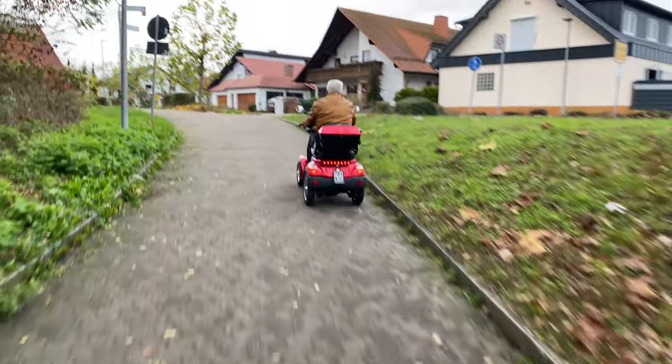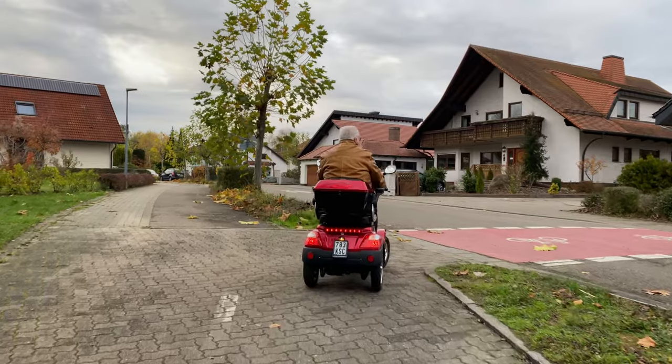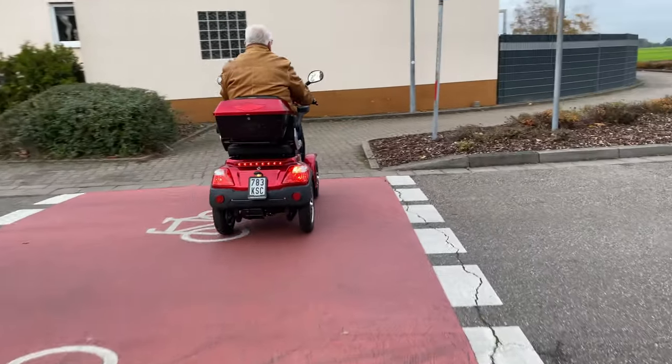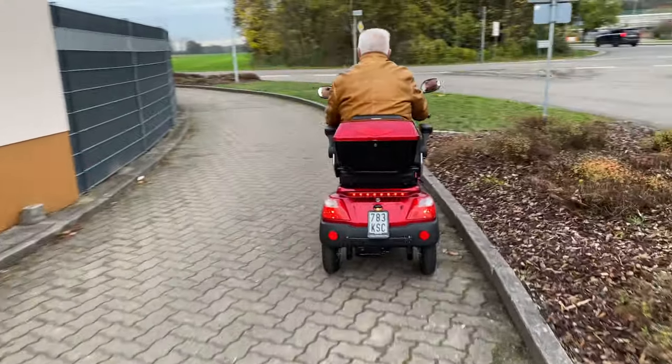The mobility scooter also accelerates well uphill. Thanks to the pneumatic tires, good suspension, and the adjustable backrest with a foldable armrest, comfortable driving is guaranteed.